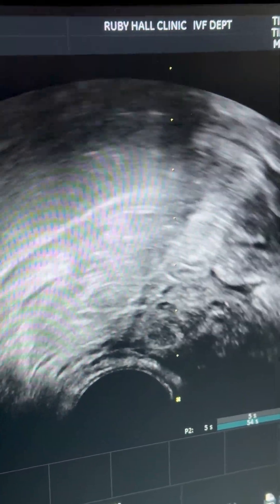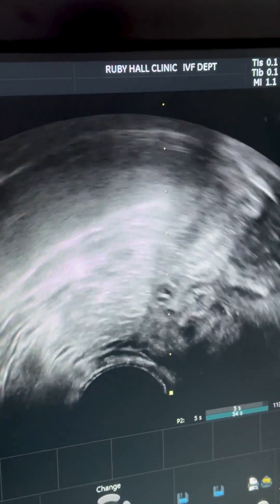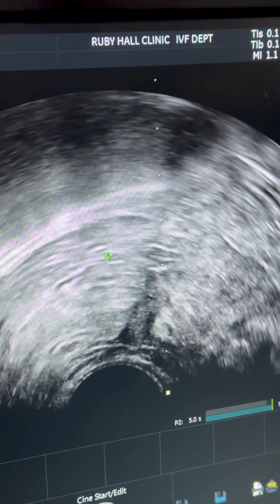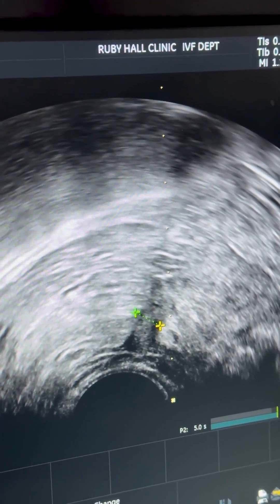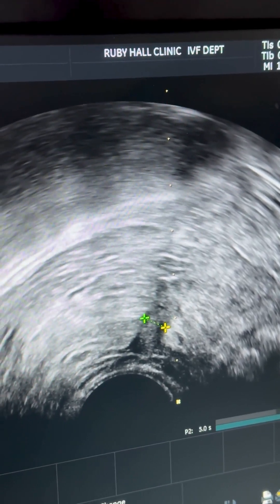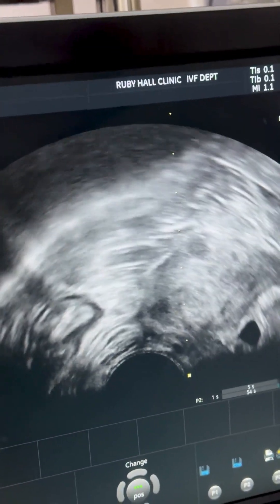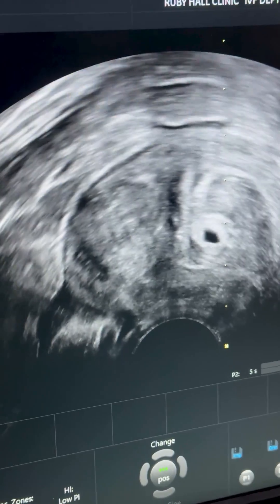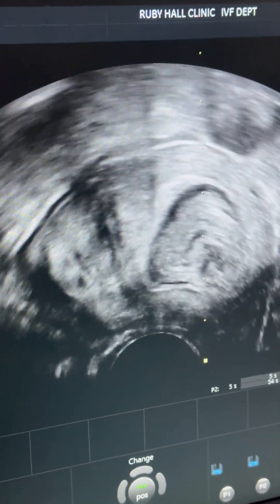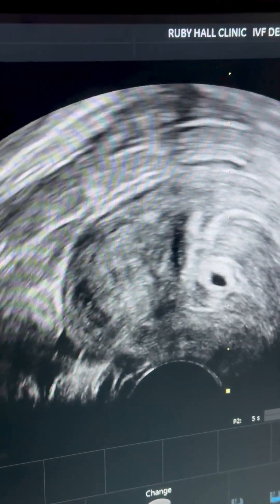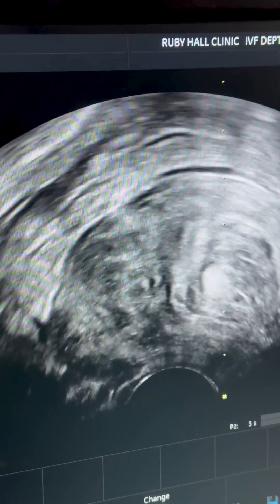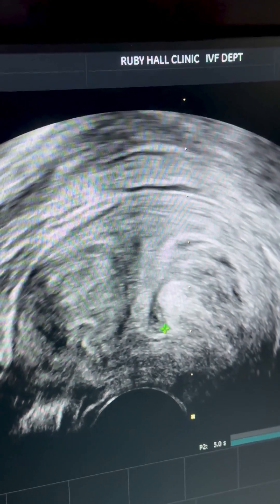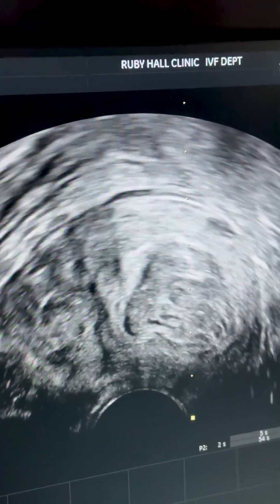This pregnancy — we could work on it. The echogenic area is my KCL which I have put up there and I will be observing. What is important to see is this is the myometrium behind — 5.7 mm. This is my intrauterine portion now and I am just going to do the suction of it. Now why am I taking out this intrauterine? Because on sonography with Dr. Mano Chinchwardkar, according to him, this whole area here is blood clot, and that blood clot has separated the sac completely. Can you see that?